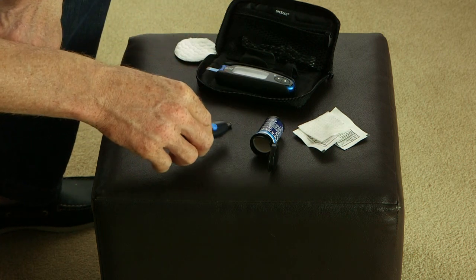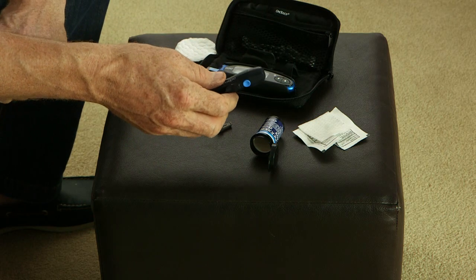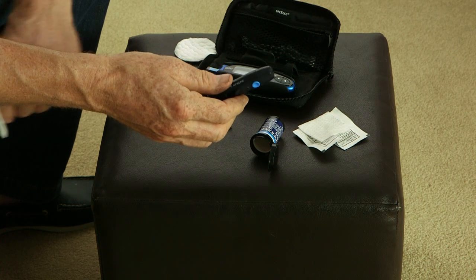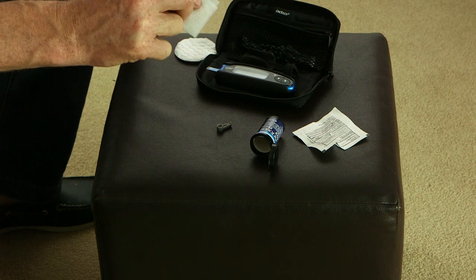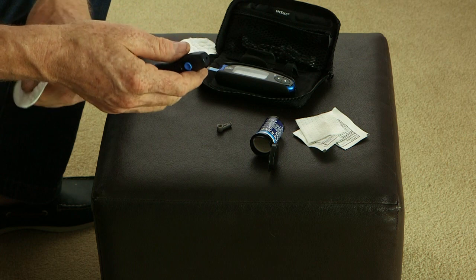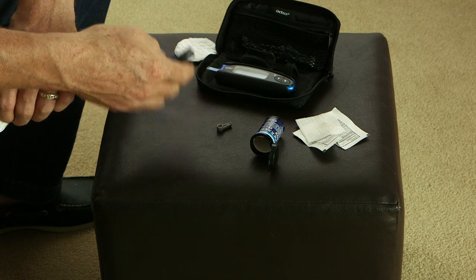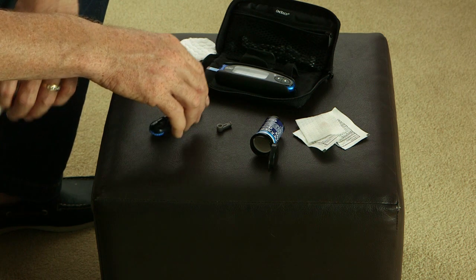And these are so tiny. You can swap out the lancets every single use. I personally think it hurts less if they've been used a couple of times. So I'll use them probably half a dozen times. And with good cleaning and good alcohol use on the site, there's really no risk for infection with these things. They're so tiny. Make sure it's just you yourself using it, obviously. If someone else were to use that, you'd want a clean, fresh lancet. But that's simple. You can log it, record it, and take it all from there.